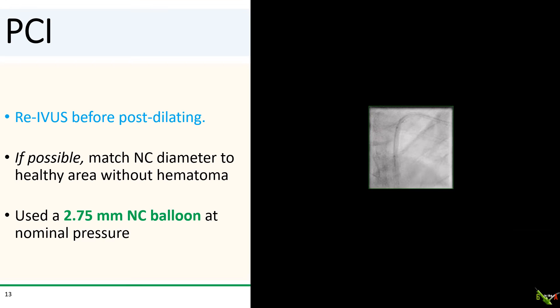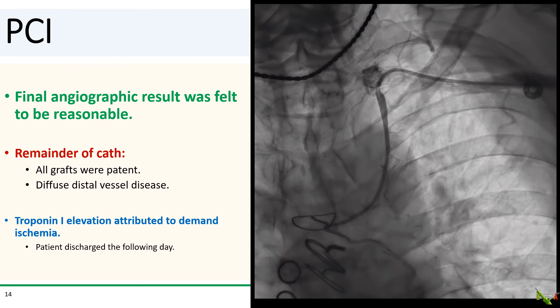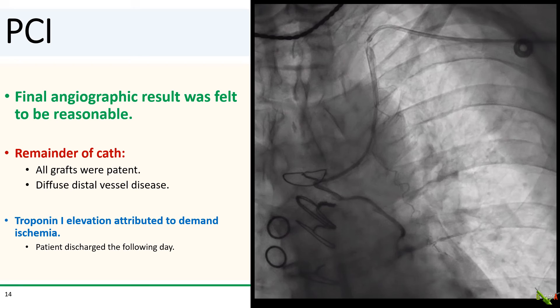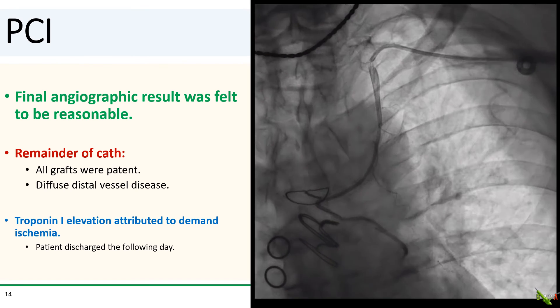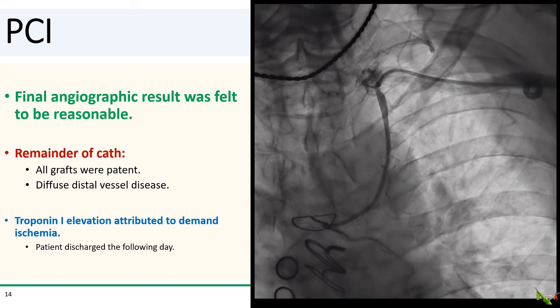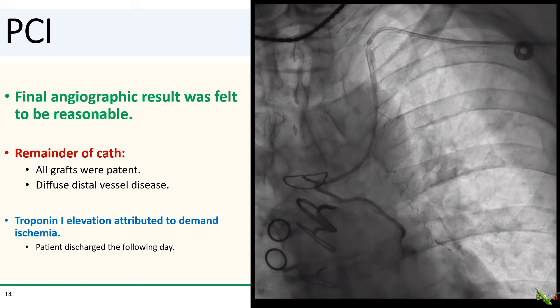Ultimately, we inflated a 2.75 mm NC balloon at nominal pressure. Here is the final angiographic result of the LIMA, which we felt was reasonable considering the limitation of the location of the dissection. We then finished the remainder of the cath — all grafts were patent, but there was diffuse distal disease. We attributed the troponin elevation to demand ischemia in the setting of his fever and pneumonia. The patient was discharged the following day.